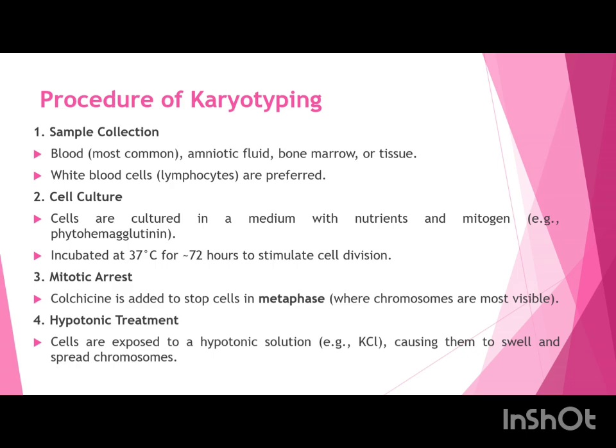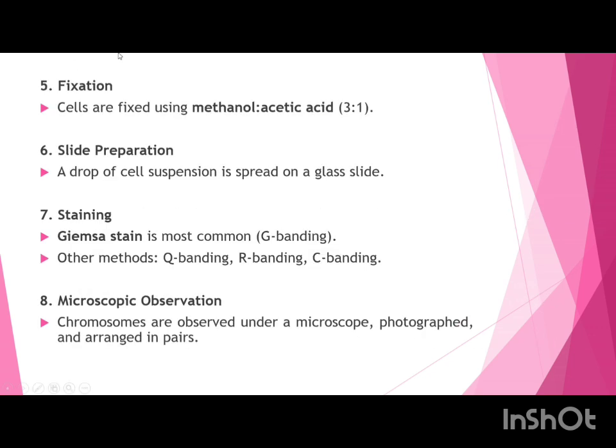Remember, we are talking about the cells. The cells are in the metaphase state, inside the cell membrane. Now we are dipping the cells in KCl so that the cell will swell. As the cell swells, it gets much more area for the chromosomes to spread. And when they are spread, it is easy to visualize. So the step is to easily visualize the chromosomes.